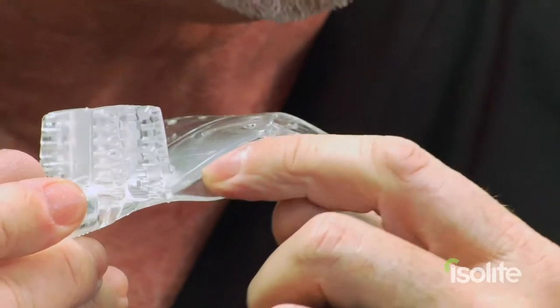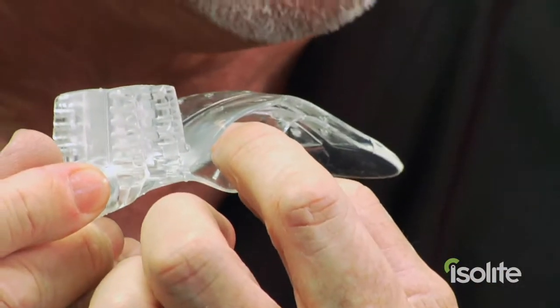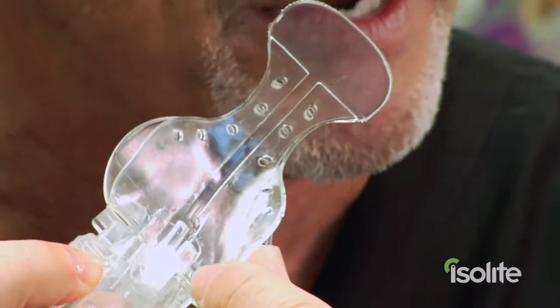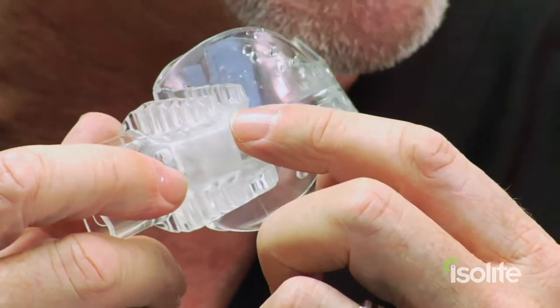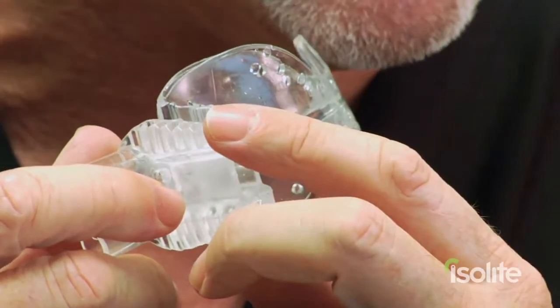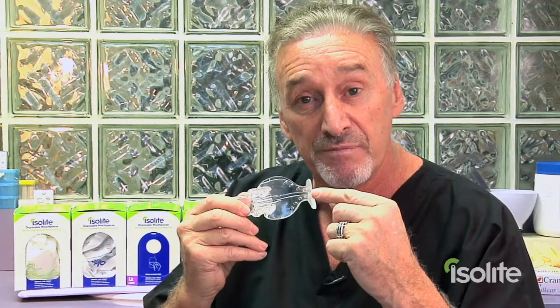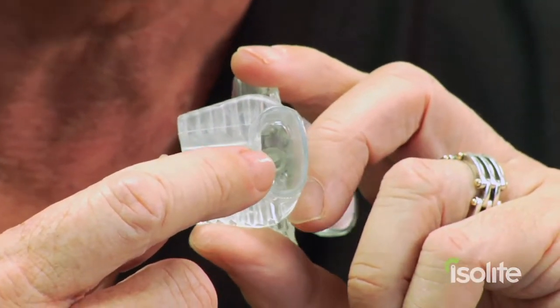The Isolite mouthpiece has vacuum channels built in, going right across here between these little flaps. It vacuums from the superior aspect as well as from the inferior aspect, and besides that it also vacuums from the back end of the bite block. So we have peripheral aspiration of fluid, including going around onto the cheek side and into the buccal vestibule as well.